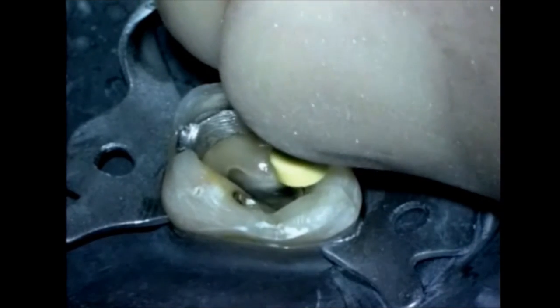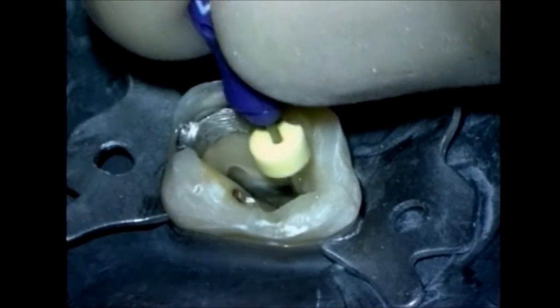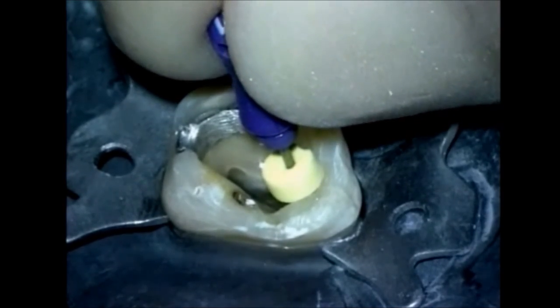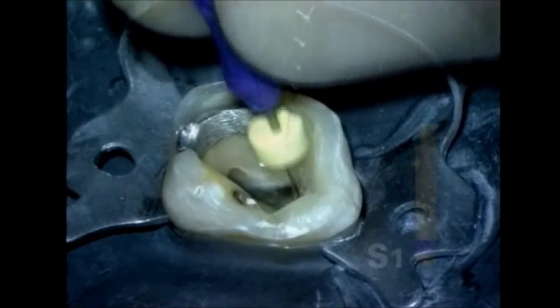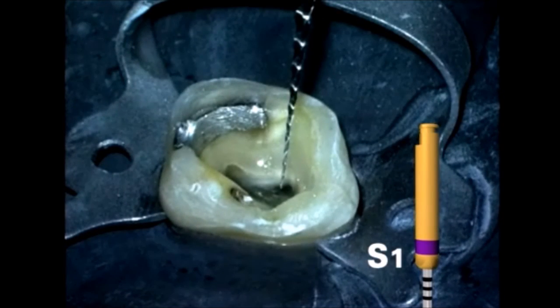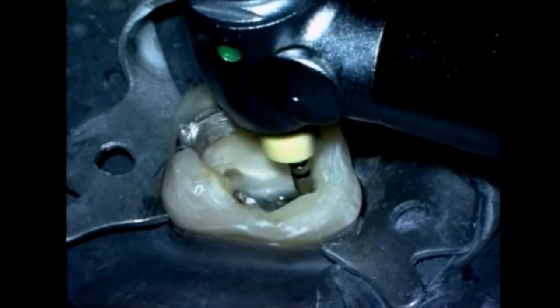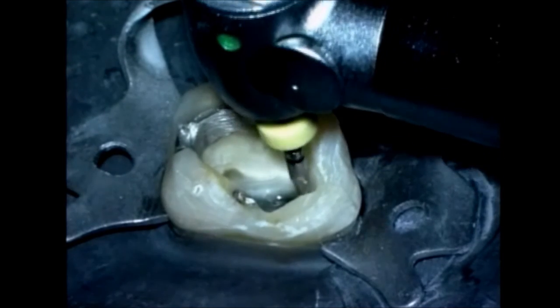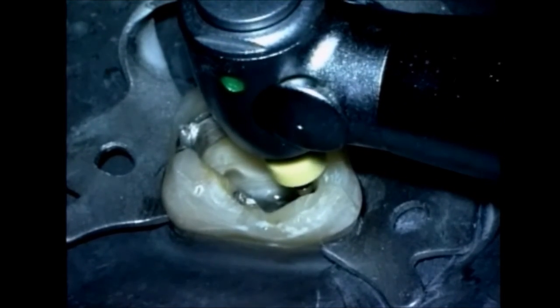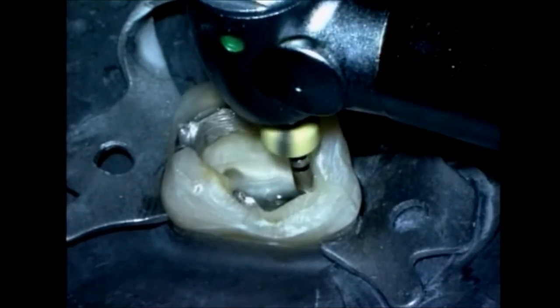hypochlorite. The 10 file is passed through the canal and we maintain patency. Little short amplitude strokes ensure patency, and progressively longer strokes confirm the glide path. We're now ready for the use of Shaper number 1. This instrument has a purple identification ring on its handle. The instrument is carried into the canal, and generally it can achieve length quite easily. Sometimes we'll lift the instrument up just a little bit to allow debris to more effectively auger up its cutting blades. Once we've achieved length, the instrument is withdrawn.